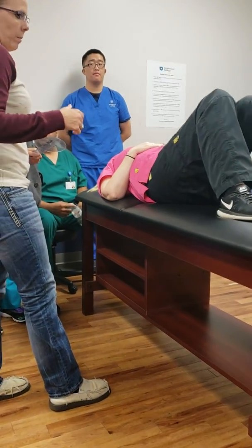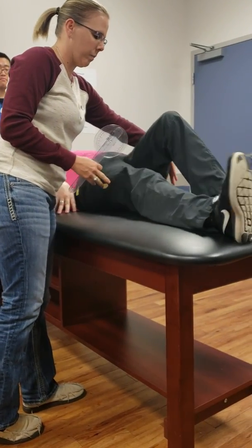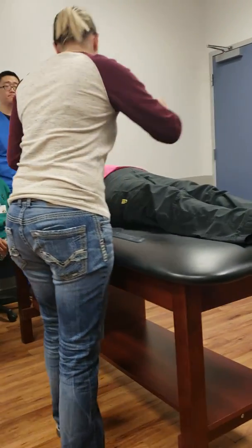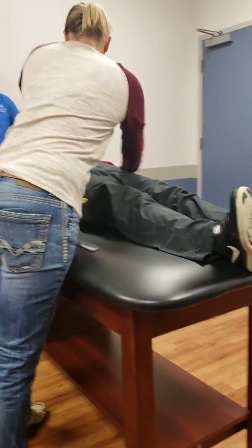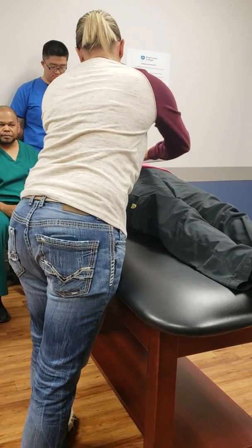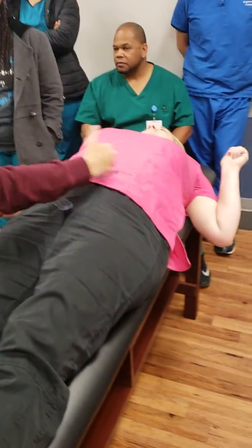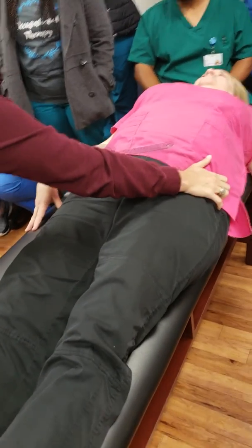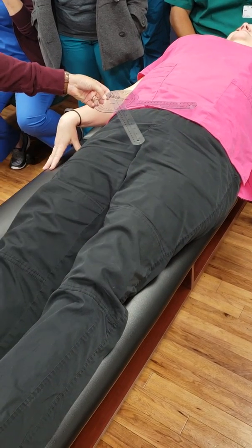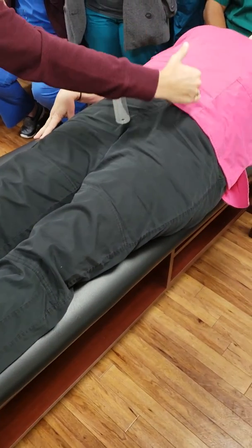For abduction, you'll want to have them go as far over to this side of the table as you can, and you can have your other leg out of the way. And then we're doing the ASIS. So we found it here. Stationary is going to be actually across the body, an imaginary horizontal line towards the other ASIS. That's why I palpated both, because I know now that that needs to be right there. And when she brings her leg out, know that your pelvis will come up. It's just natural. You want to make sure that you're still in that line.